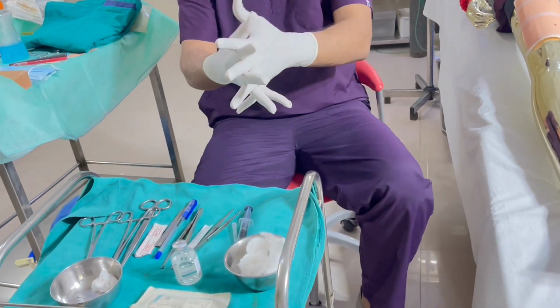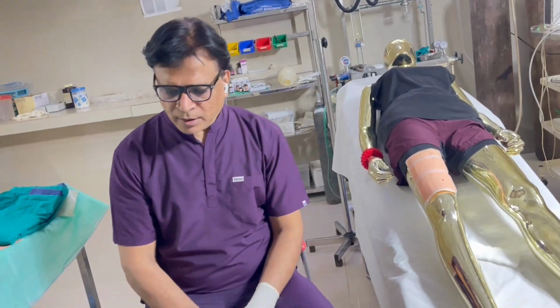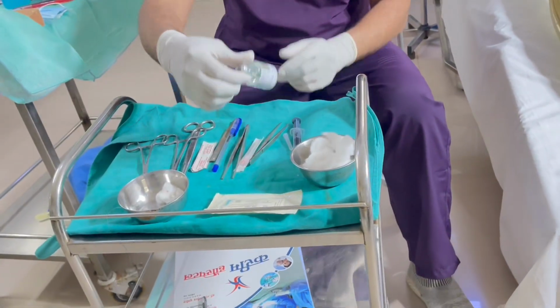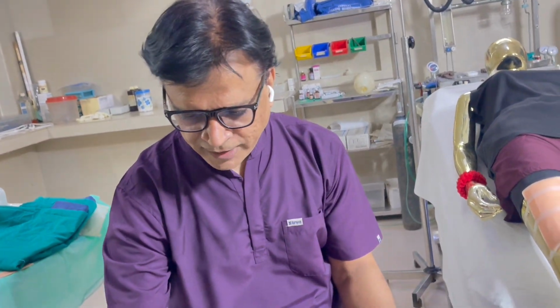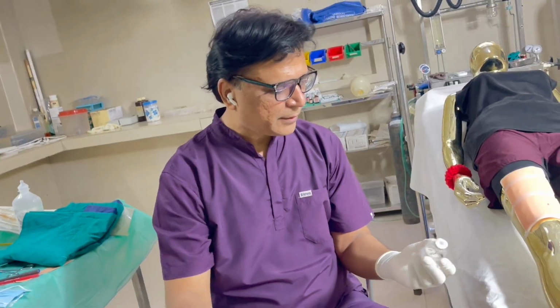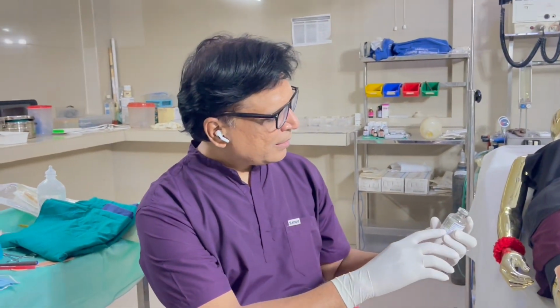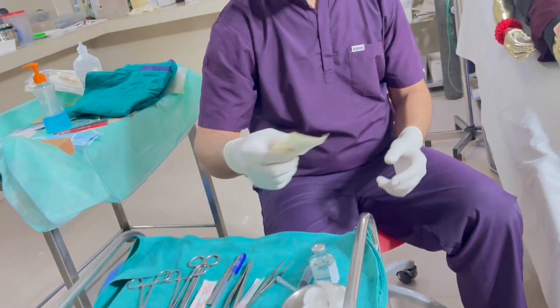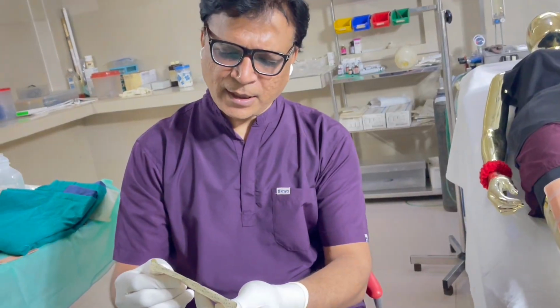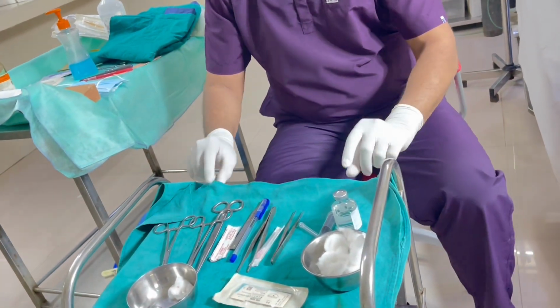First of all, I have already put on the gloves. The person is painted and draped, and first of all, I will check the anesthesia. Smith, what is your probable age and weight? Do you remember the weight? Okay, it's around 40. So this is the Xylocaine, the expiry date is 29 December. Okay. Now the suture material, I can check the expiry date on it. It's again 28 December. So all the instruments are ready.